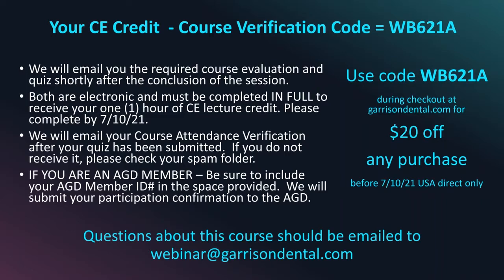You need Viscostat, Hemodent, cord, all of those things can help. I have a whole technique for managing subgingival preparations that I know I'm going to run into a lot of bleeding, and how to manage that bleeding. I would need to show you that hands-on to really explain it well. Great course opportunity. Yeah, well, those are situations. If you have a laser on hand, or something like a radiosurge unit, there are ways to give yourself the best chance at success.